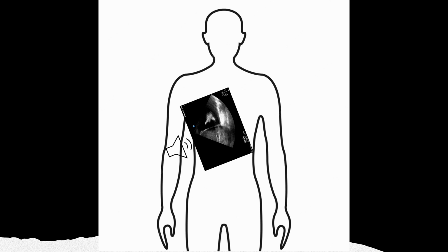And in this particular patient, this is what I see. You can see that there's liver inferiorly. You can see a vessel somewhere in that liver. You can see a lot of black, and then you can see something flopping around, and that's essentially called a jellyfish sign because that's collapsed lung and there's fluid all around it.